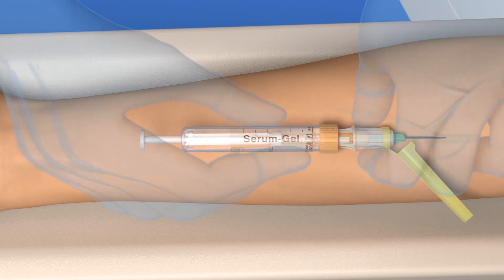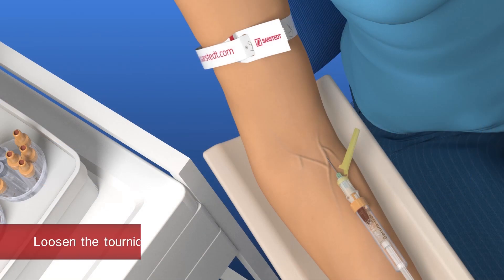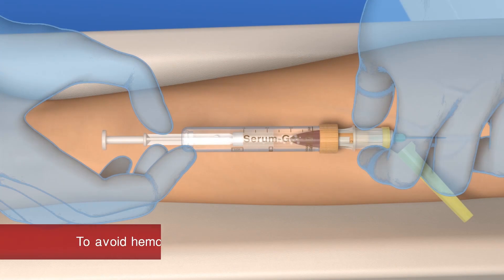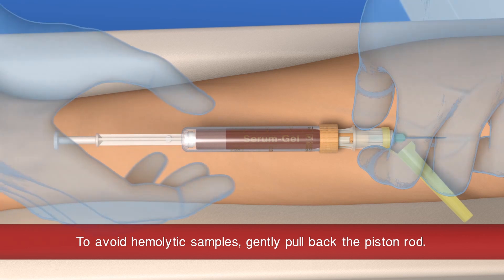Upon successful puncture, blood will begin to flow into the S-Monovette. To avoid hemolytic samples, gently pull the plunger until it will go no further and wait until the blood flow stops.